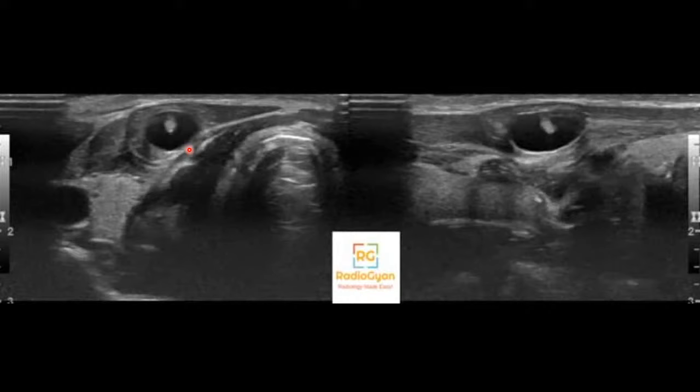will present. The interesting thing, I don't know why, but these are commonly seen in superficial muscles, say strap muscles, temporalis, abdominal wall muscles, back muscles, which is a good thing for us because the patient will present with a swelling and we'll be able to see these on ultrasound really well. So this was a case of cysticercosis.